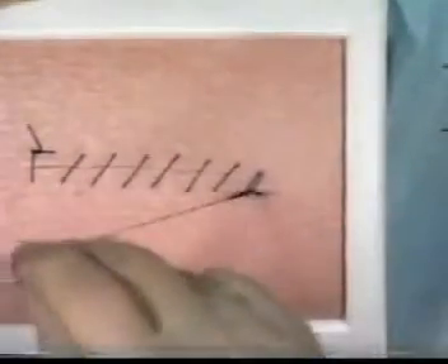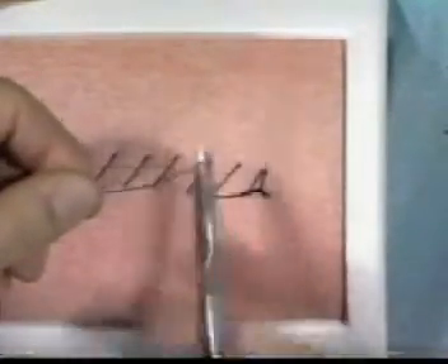After six or seven throws, the long thread may be pulled entirely through the loop, drawn tight and then cut.